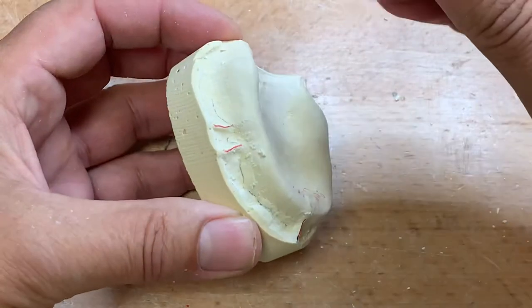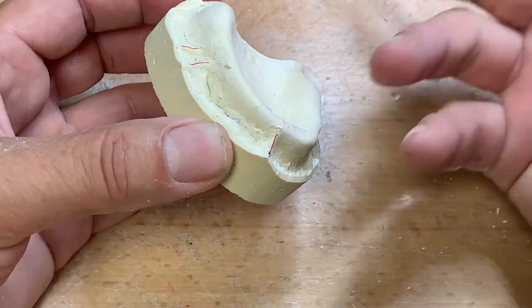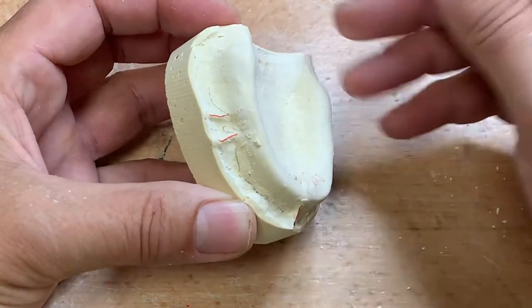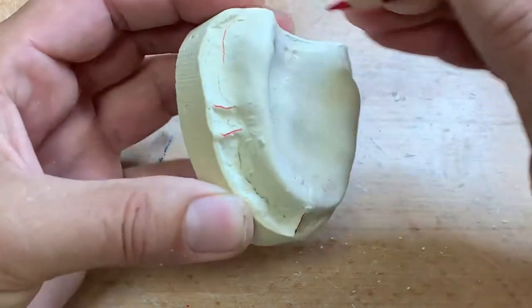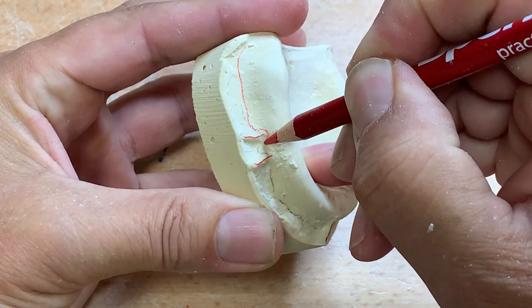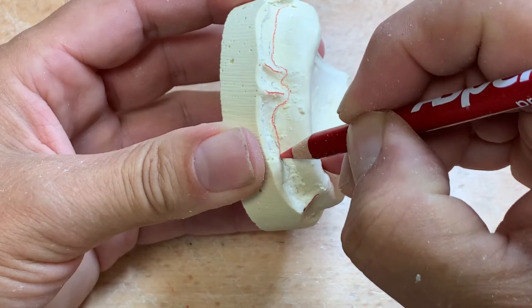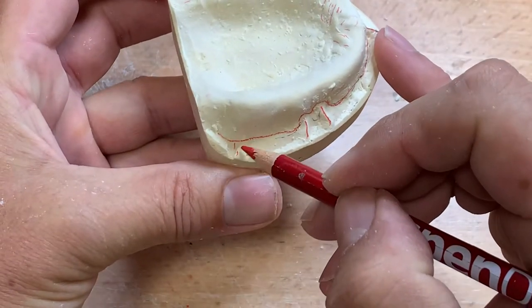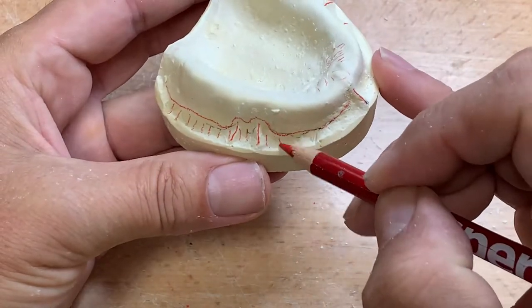These frena have been overextended, and if we were to create a denture on a model like this, they would prevent the denture from seating, or it would be dislodged immediately — you could simulate a trampoline effect on these muscle attachments. So we should take our pencil and, at the deepest part of the sulcus, try to imagine where we can read the impression of the attached and detached mucosa, because this is going to be our denture border — definitely the border of the tray.